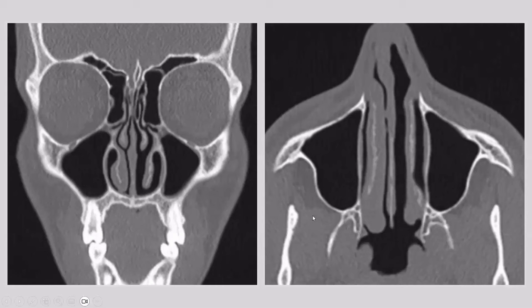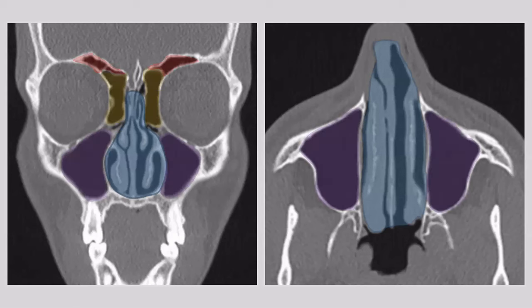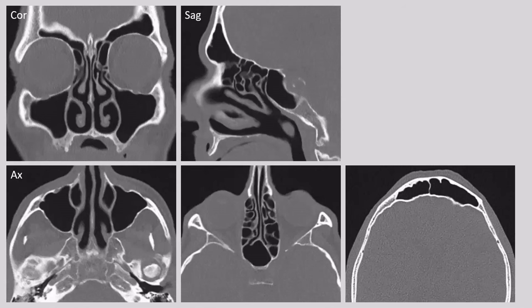This is what the nasal cavity looks like on an unenhanced CT in bone kernel. We see next to the nasal cavity a group of air-filled structures — these are the paranasal sinuses. We can identify the maxillary sinuses in purple, the ethmoid sinuses in brownish, and the frontal sinuses on top. Still lacking are the sphenoid sinuses, but we will see those on one of these images.